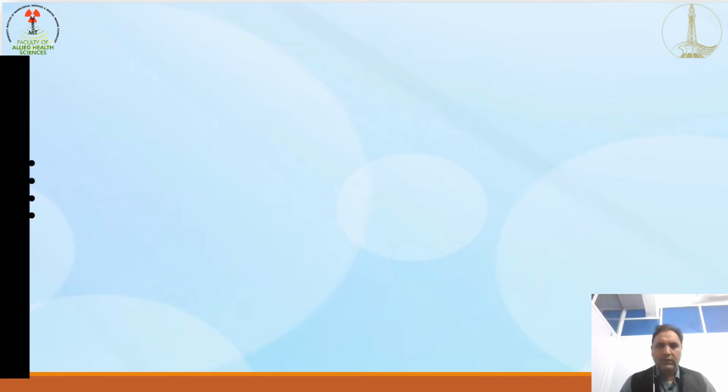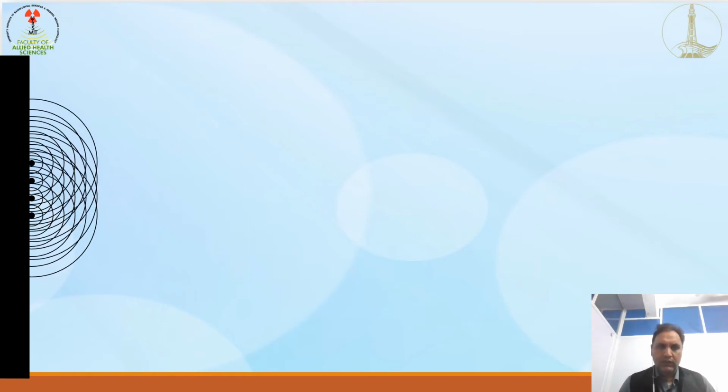So here I made this slide especially for you to describe this beam profile. Here you can see there are four sources. They are vibrating at the same time, generating sound wavelets, and these wavelets in the medium combine with each other to form the beam profile.